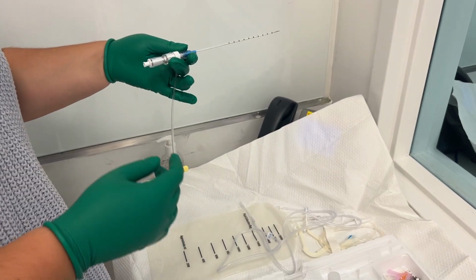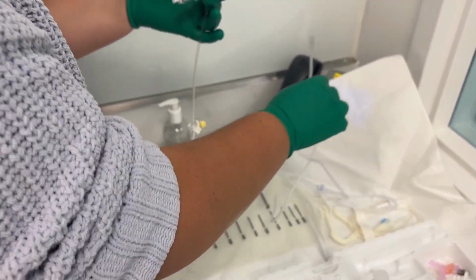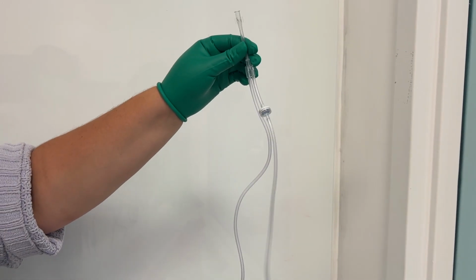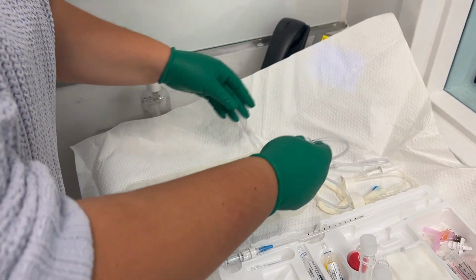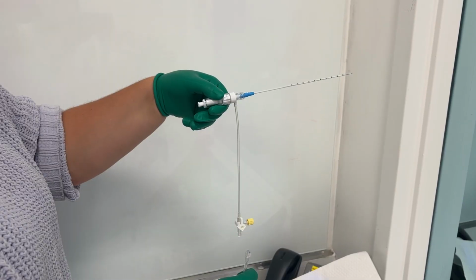Now we'll talk about the setup for therapeutic paracentesis. First, you'll notice this tubing has several pieces to it. The head, the longer tail, and the shorter tail. The shorter tail attaches to the stopcock.